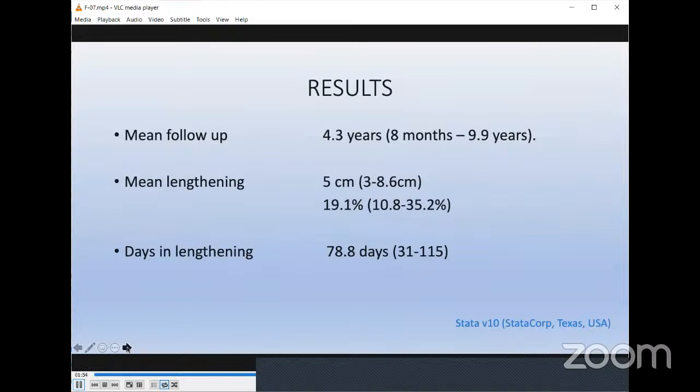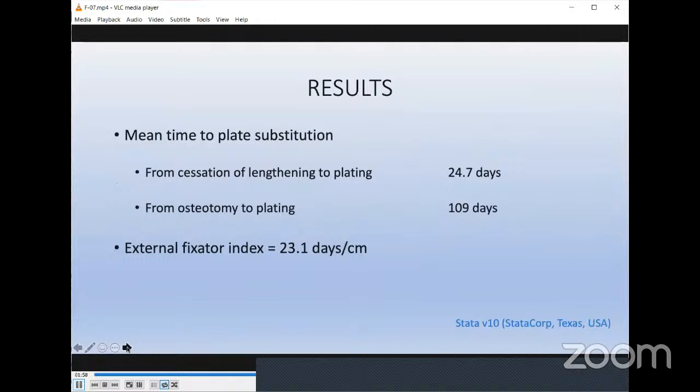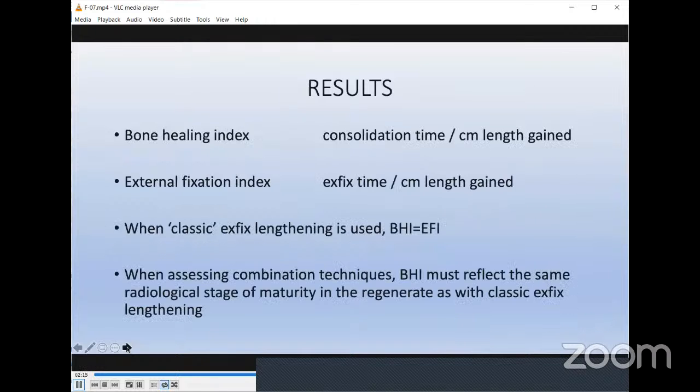5 centimeters or 19% lengthening was achieved in 78 days. Initially, the time to plate substitution was higher, but this improved towards the end of the study, the mean being 24.7 days. This can be optimized further to 7 days with prior planning. External fixator index was 23 days per centimeter.